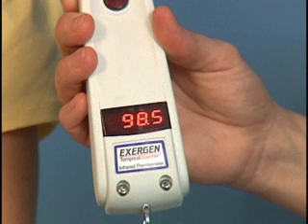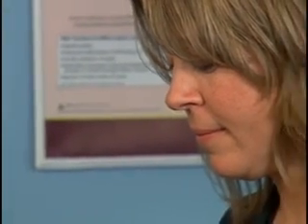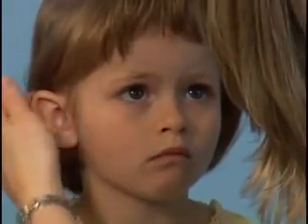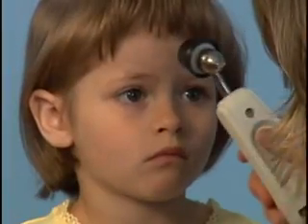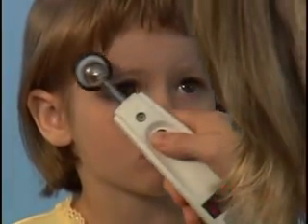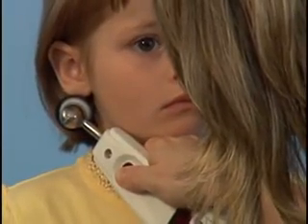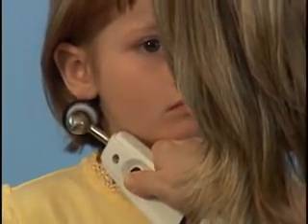Katie's temporal artery temperature is 98.5 degrees Fahrenheit. Make a mental note of the temperature reading. The display will remain on for 15 to 30 seconds. If the temperature needs to be taken again, wait 60 seconds or scan the opposite side of the forehead. Scanning cools the site, and rescanning too quickly leads to a falsely low reading.